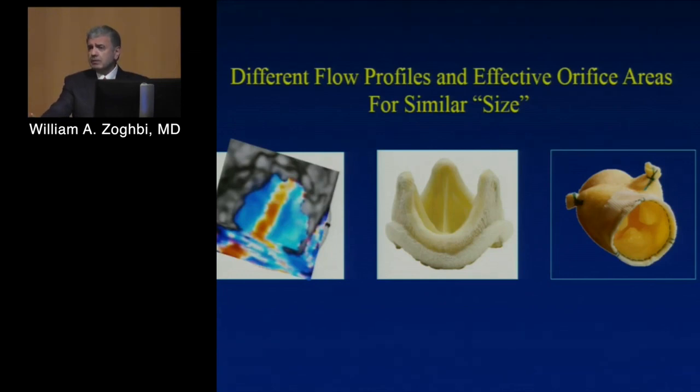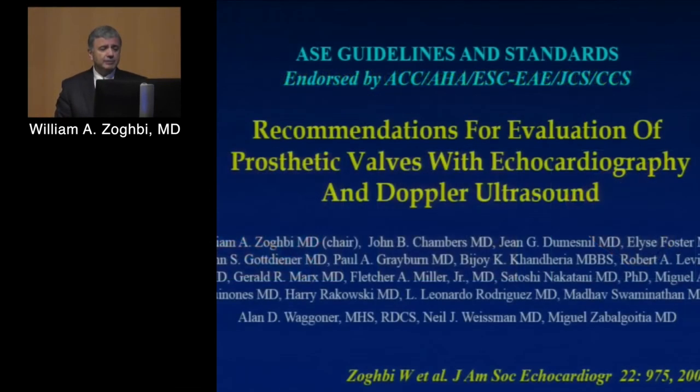And what does that mean? Well, it means that the hemodynamics in a bileaflet prosthesis, to start with, because you really cannot differentiate these orifices, will be higher than normal. The gradients will be higher than what actually is measured at catheterization. However, we've already incorporated all these normals, quote unquote, in our normal values, and therefore you would refer to the normal values of a bileaflet prosthesis, be it in the aortic or the mitral position.